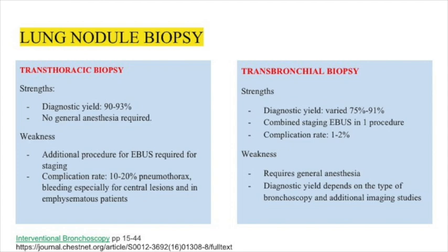The benefit of this type of biopsy is that it can combine the staging EBUS in just one procedure, so the patient goes home with the malignancy diagnosis and staging at the same time, with a relatively low complication rate of only 1 to 2% of the time. And I'm talking about lung complication rates such as pneumothorax, lung collapse, or bleeding.